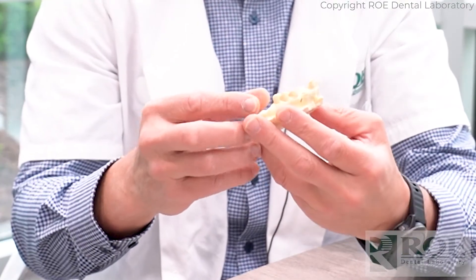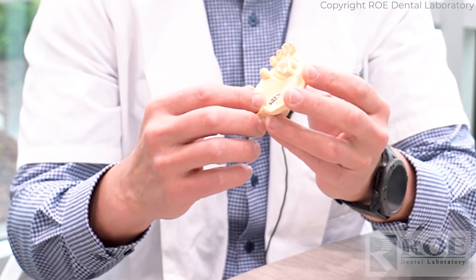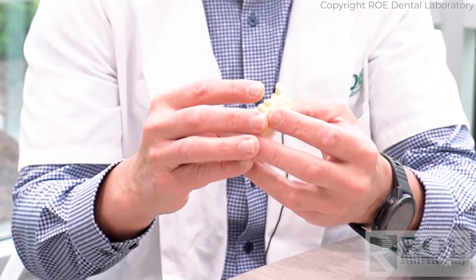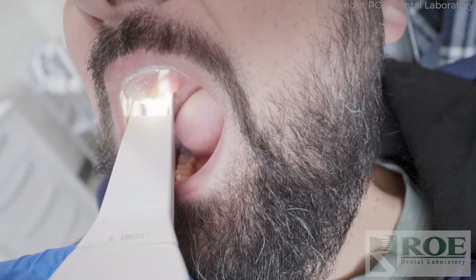When you scan for an immediate denture, it's important to capture all the land areas. If you have an issue with your scanner capturing the palate or post-palatal seal area, you can always take a conventional impression, pour it up, and scan the stone outside the mouth. All land areas are critical, just like with any denture — we have to make flanges, a post-palatal seal, etc.